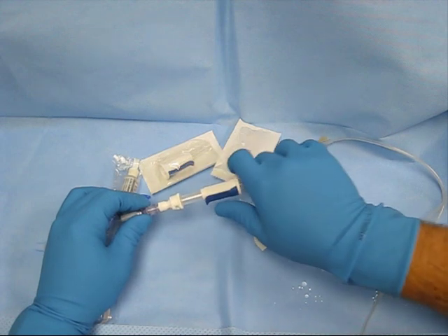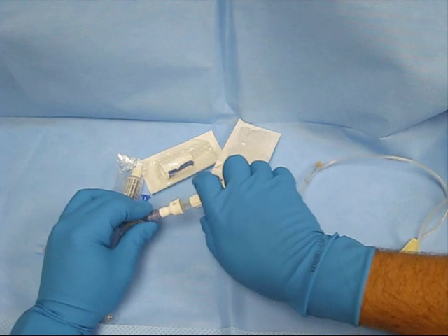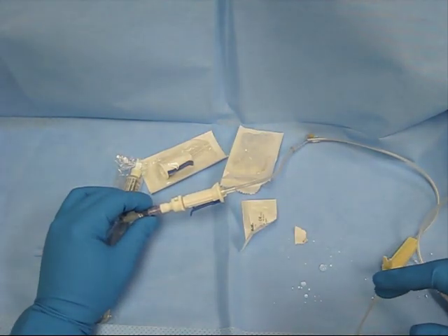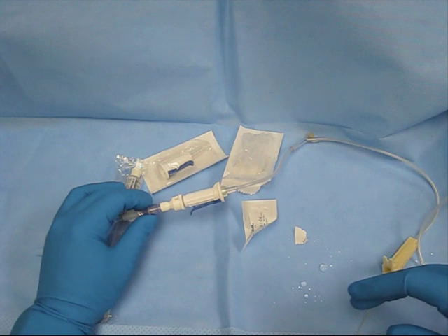Once you have it connected to the patient, pull this blue actuator back and shove the needle into the connector. You can now start your infusion. Go ahead and give your infusion through the amount of time that is on the label or as instructed by pharmacy.